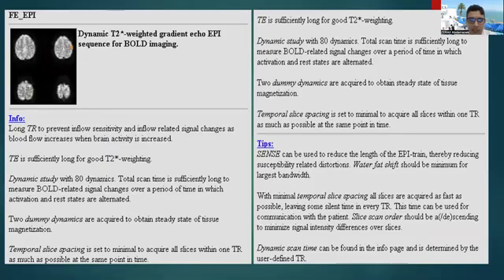And this is the field echo EPI. No, this is the dynamic T2 star, which was used with different paradigms, for example for the visual, for movement, for thinking, and for talking. Different radiologists or scientists give us some paradigm to understand what mechanism inside the brain you can work with. So this is the image.